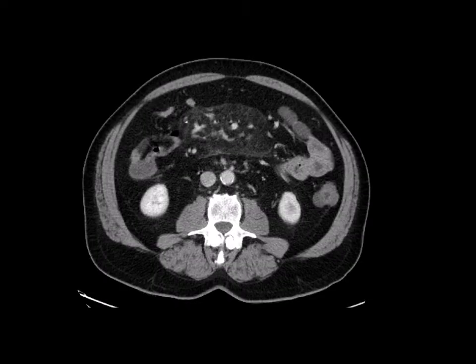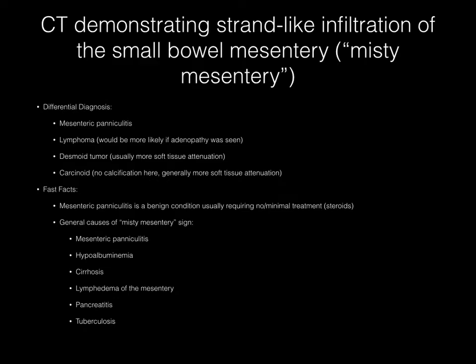Now pause your media player. This axial CT image demonstrates strand-like infiltration of the small bowel mesentery, the so-called misty mesentery sign. The differential diagnosis should include mesenteric panniculitis, which I feel is most likely here. Lymphoma is a possibility, although this would be more likely if adenopathy was present. A desmoid tumor could be added to the differential, although these are usually more soft tissue attenuation. A carcinoid tumor, while it could be included in this differential diagnosis, would generally also be more soft tissue in attenuation and would typically have calcifications associated with it.